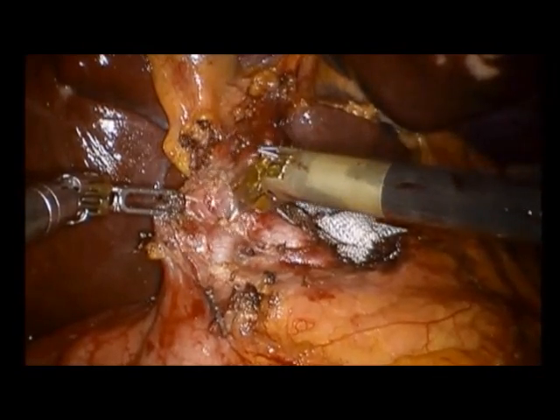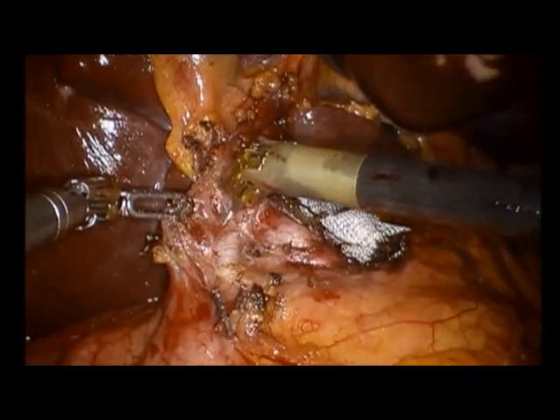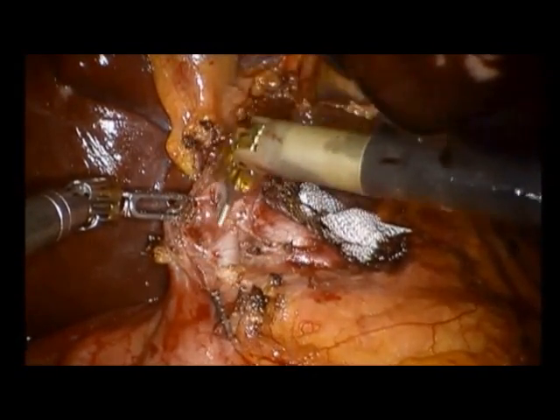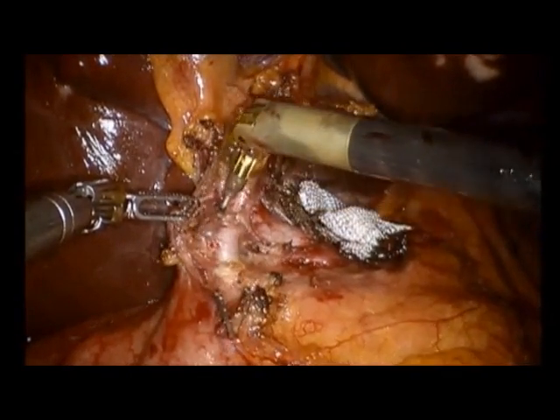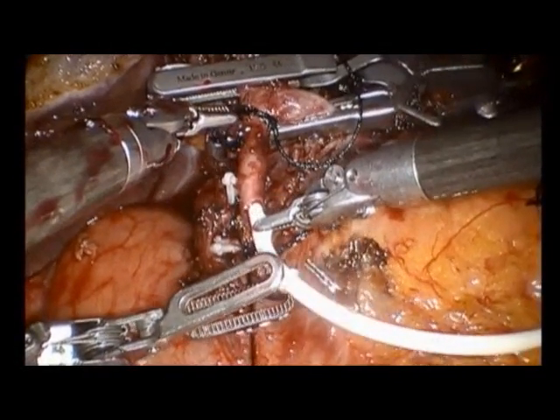Robotic surgery is also a valuable method for doing fine dissection around the liver. The wristed instruments allow for accurate dissection. Here, the hepatic artery and gastroduodenal artery are dissected. A hepatic artery infusion catheter is sewn into the gastroduodenal artery.